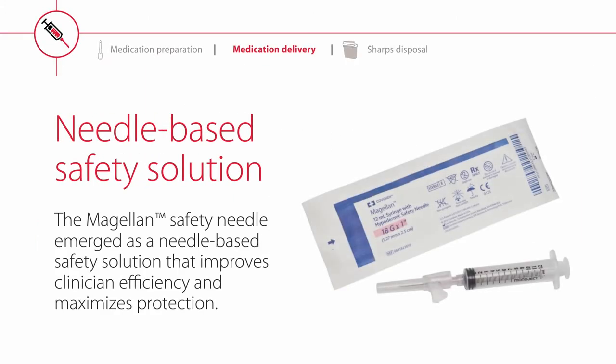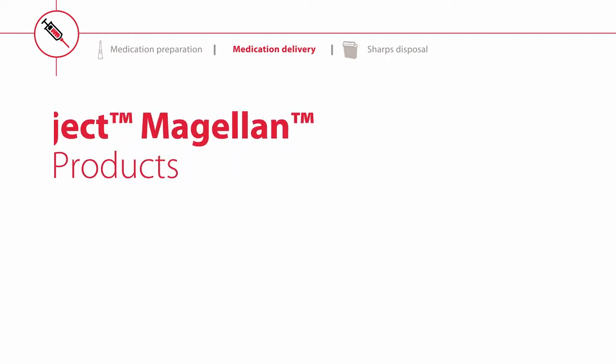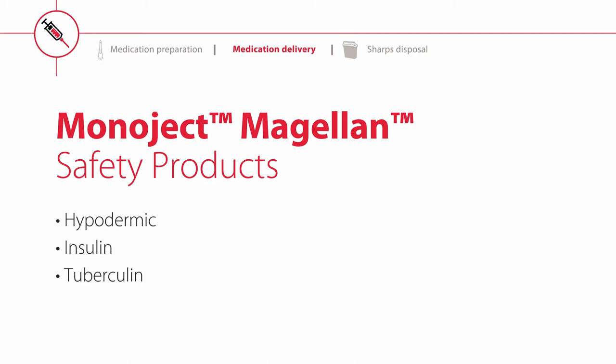After years of development, the Magellan Safety Needle emerged as a needle-based safety solution. Cardinal Health offers an extensive portfolio of Magellan safety products that includes hypodermic, insulin, and tuberculin products.